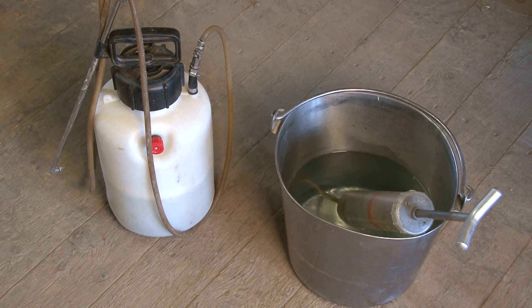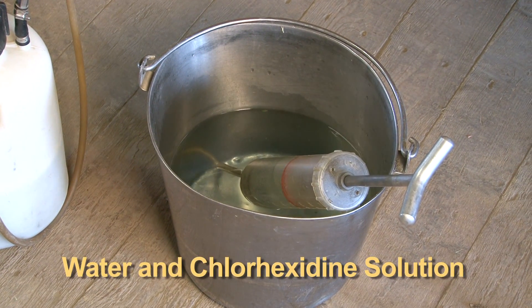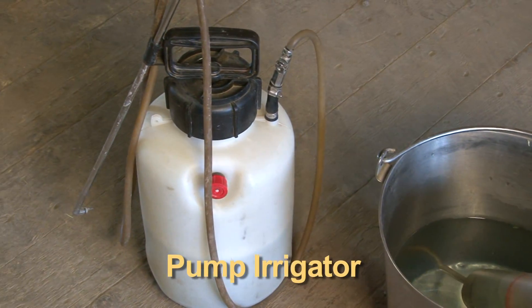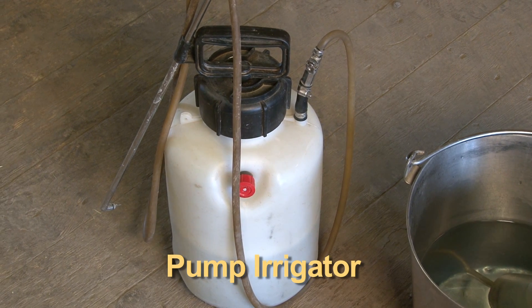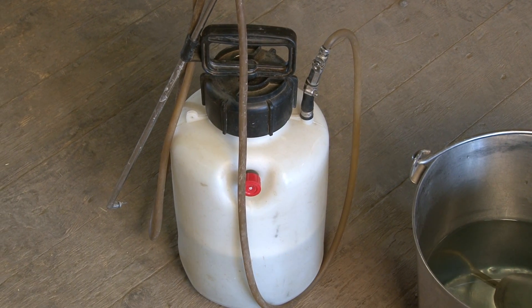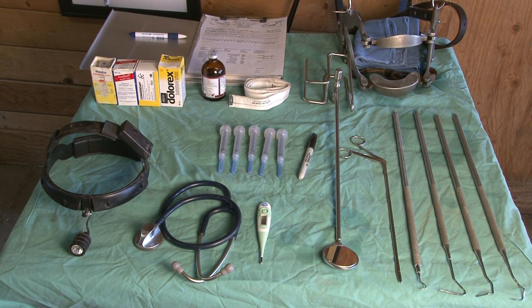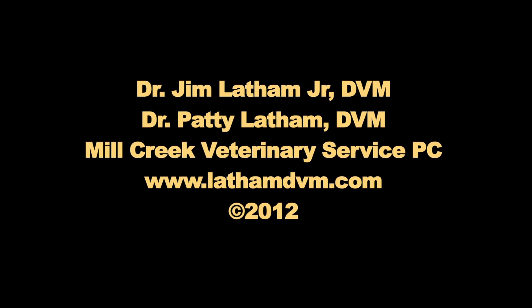Just a bucket of water with chlorhexidine in a dilute solution, and on the left is a pump irrigator that can be used to clean diastema, infundibular cavities, and get to all the nooks and crannies of the oral cavity as necessary. Now we'll proceed with the examination of the horse.